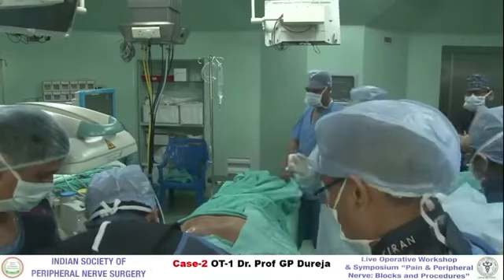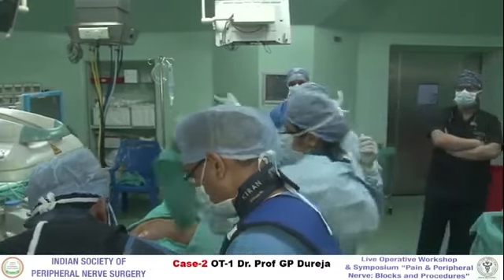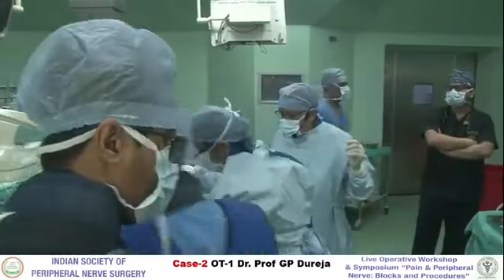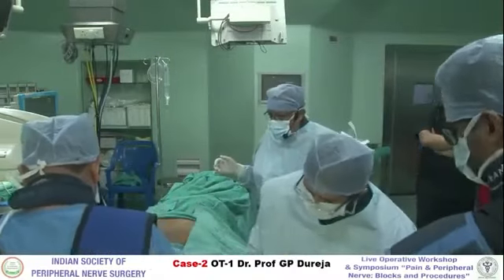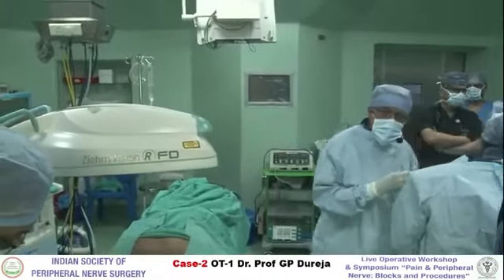Most of the interventional spine procedures, we hardly use more than 4 ml. Dilution is important if you are anticipating a large volume of dye to be used, like in failed back surgery.